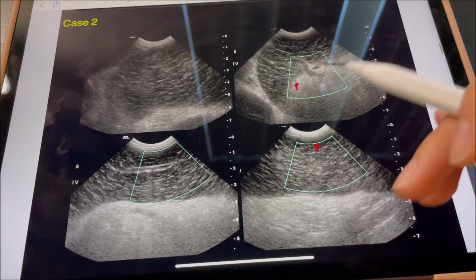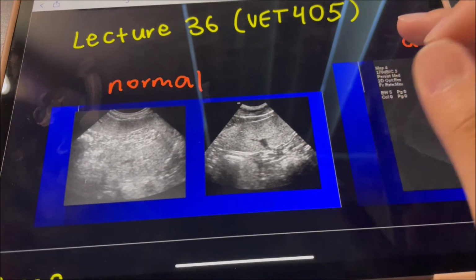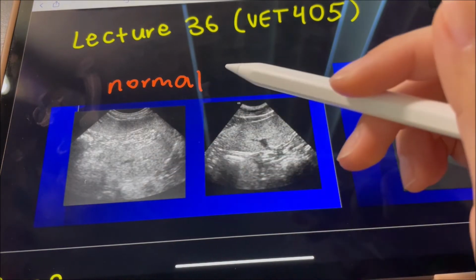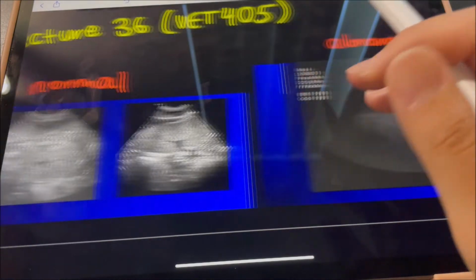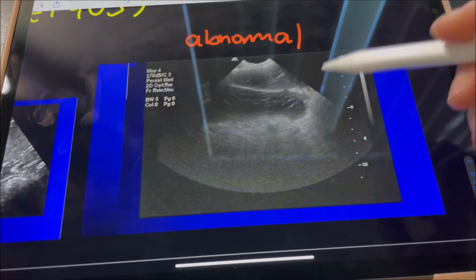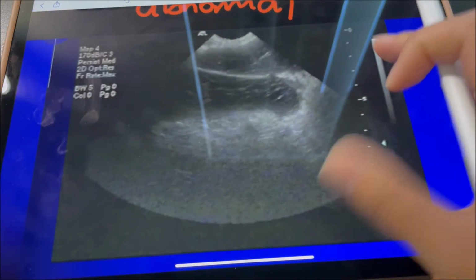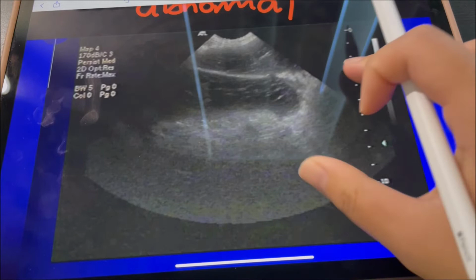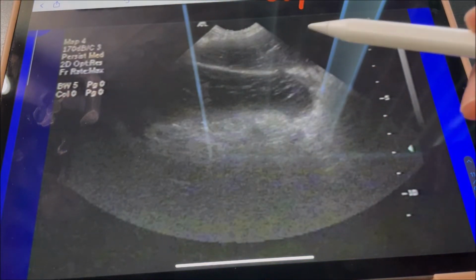So the next step to decide whether it's neoplasia or torsion is to perform an ultrasound. And before we look at our patient's spleen, let's look at what a normal spleen looks like. So remember that a normal spleen has sandpaper echotexture and a hyperechoic parenchyma. An abnormal spleen, if it was splenic torsion, would have a hypoechoic parenchyma with these linear hyperechoic bands representing fibrous tissue, so it looks like Van Gogh's Starry, Starry Night because the spleen is congested and dying.